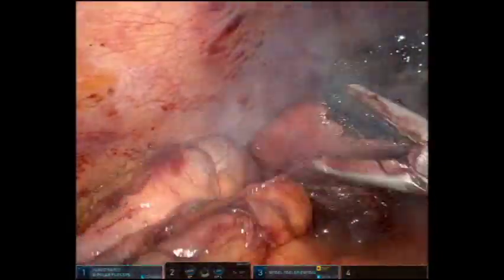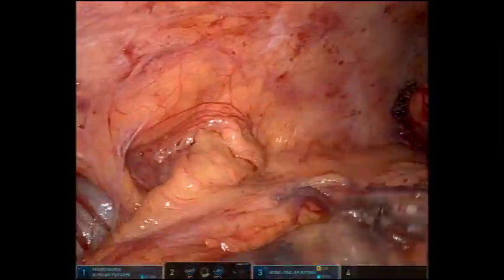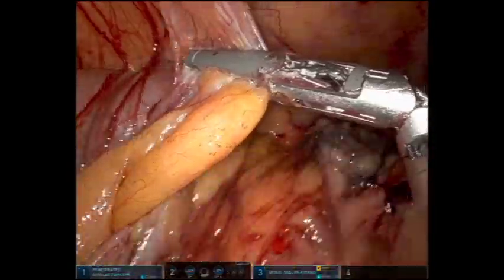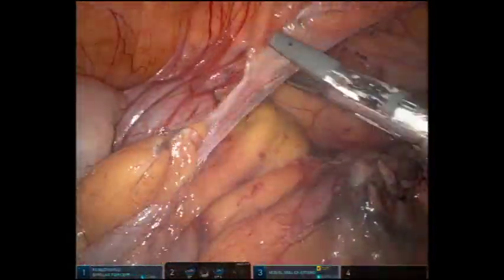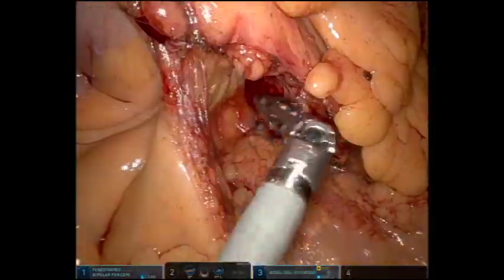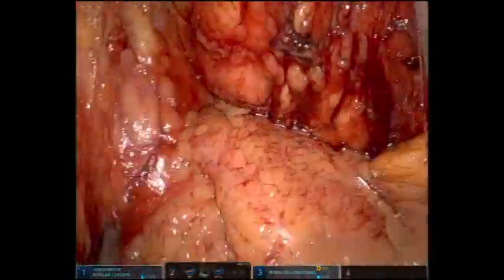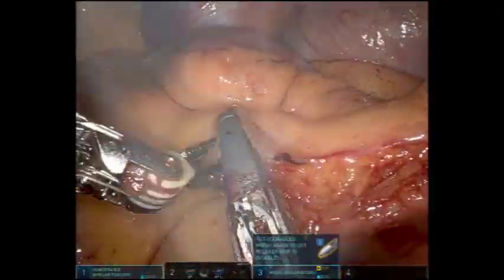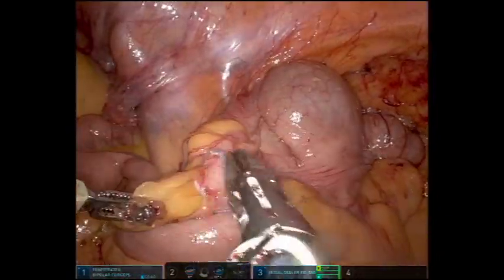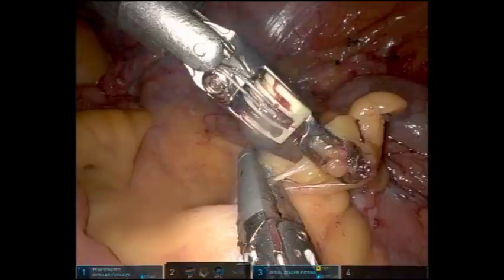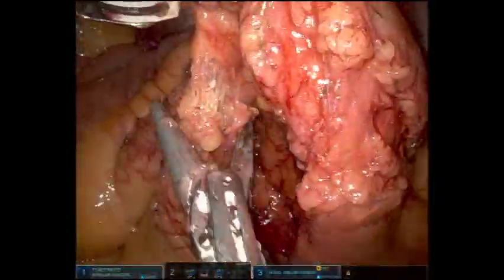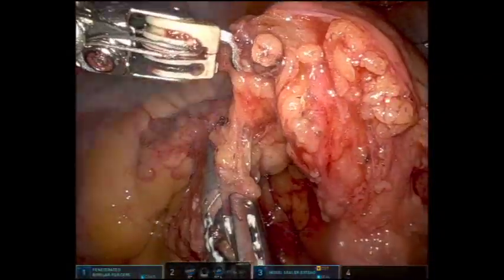With the duodenum being completely mobilized, the hepatic flexure can be taken down quite quickly. The remaining lateral attachments are then taken down using the vessel sealer. Starting at the previously transected ileocolic vessels, the mesentery of the terminal ileum is taken down using the vessel sealer and ligated all the way to the bowel wall.